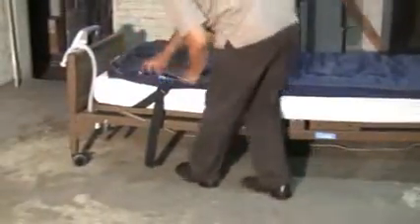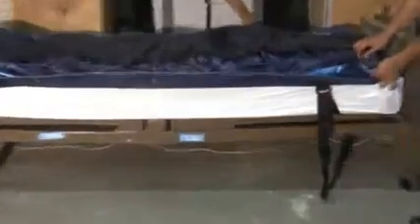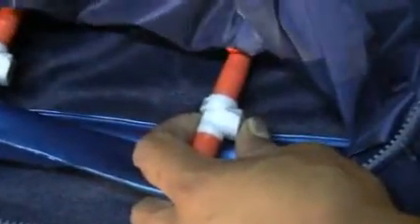Now that our overlay has been strapped down to our regular spring mattress, you may go ahead and inspect the mattress for further instruction and installation. You would like to unzip your Plexus 2200 overlay top sheet in order to inspect your air manifold connection to the cells. This is the air manifold here, and this is the cells.